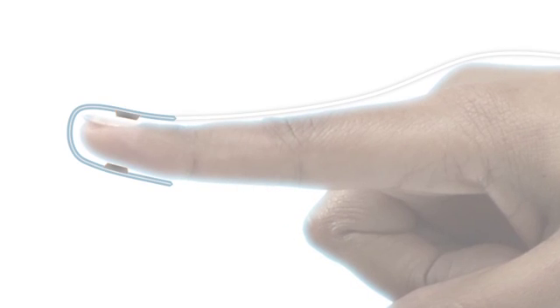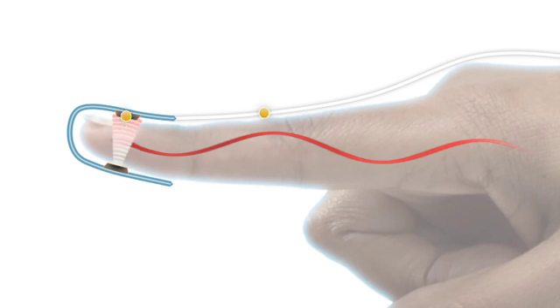Nonin sensors have an emitter that projects a tuned light wave pattern through the arterial blood and a detector which receives that light. Changes in the light wave spectrum during pulsation of blood generate a measure of blood oxygenation and pulse rate sent to the pulse oximeter.